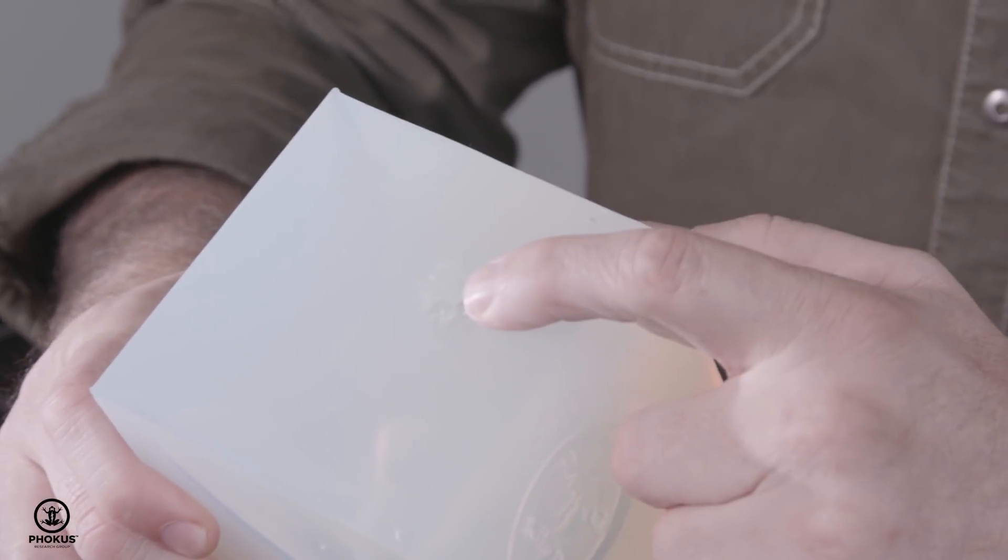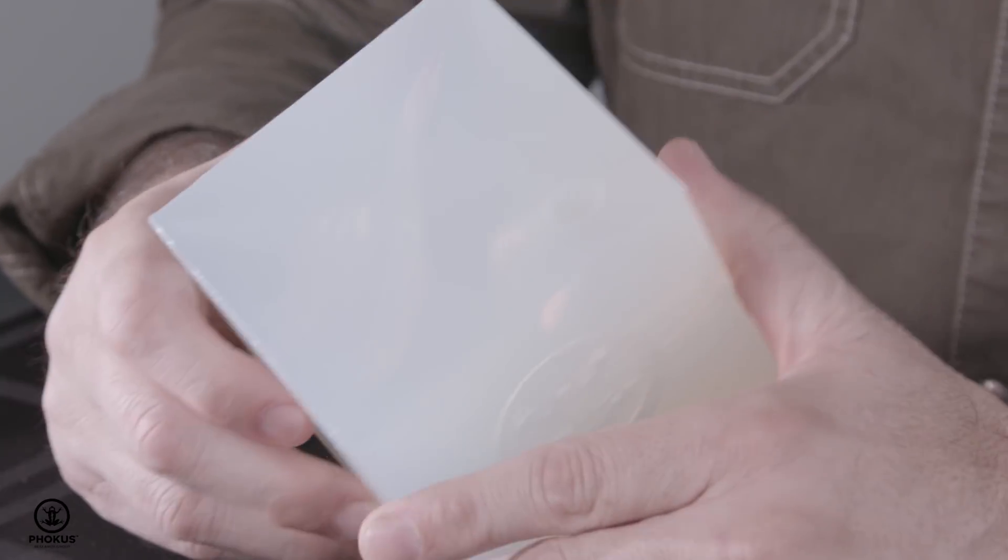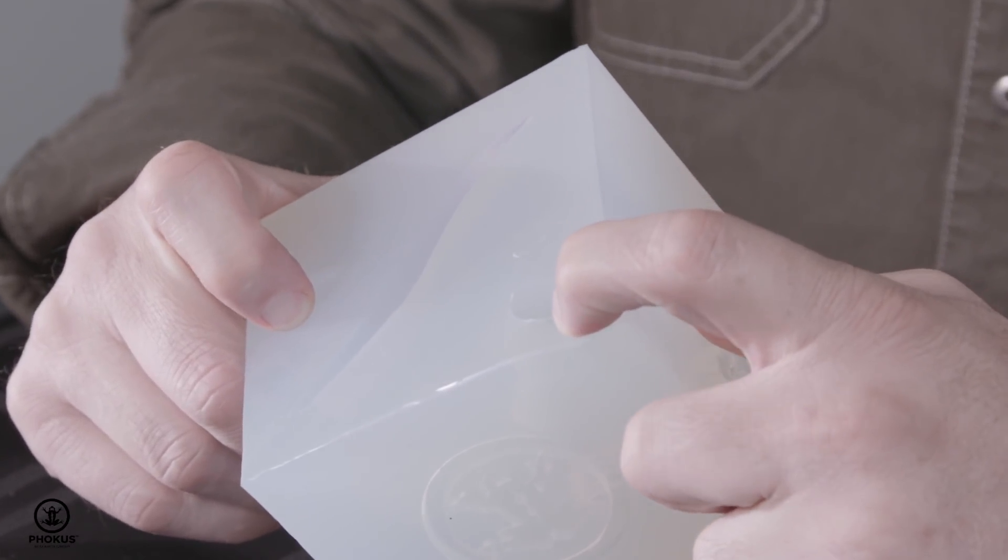We added four realistic wound patterns. We've got a small-bore gunshot wound, a large-bore gunshot wound, a laceration, and then a very small 5.56 penetrating trauma.